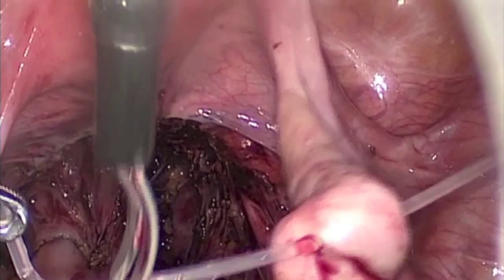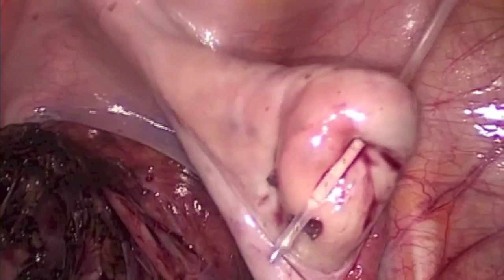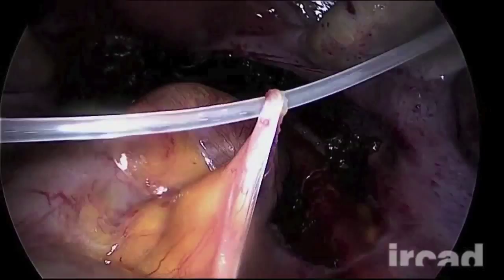At the end of the procedure, the device can be removed either by cutting its tip and extracting the two parts separately, or by grasping the thick arm and pulling the device out through the trocar. Organ suspension with the T-Lift device is easy and fast. Exposure of the field is improved, providing safety and simplifying the surgery.